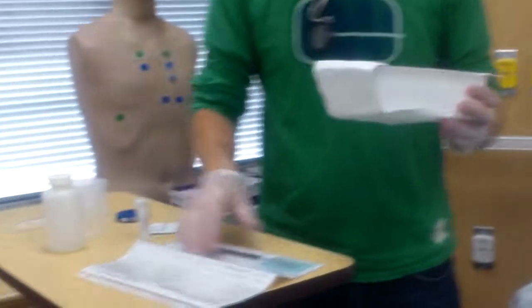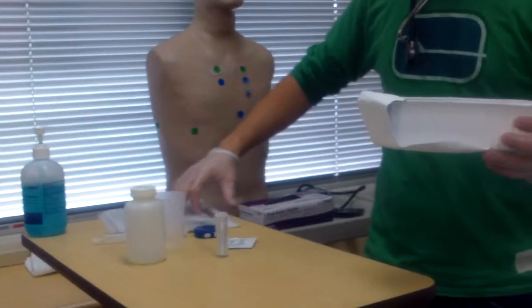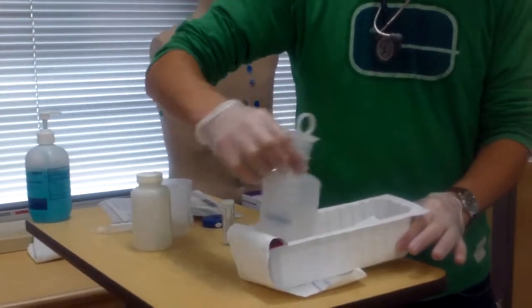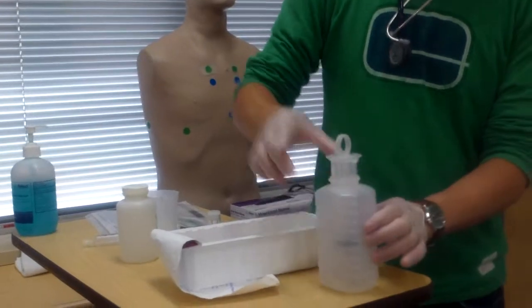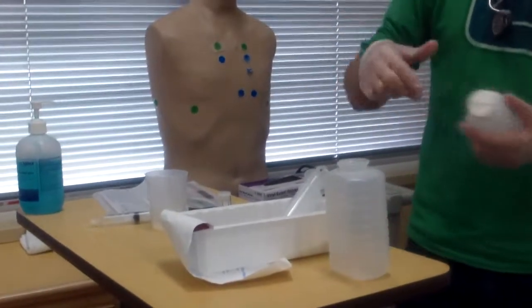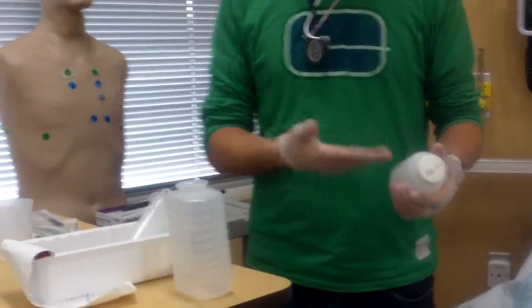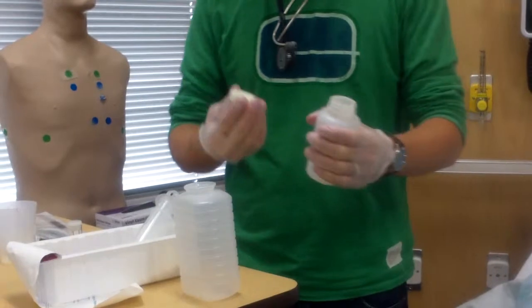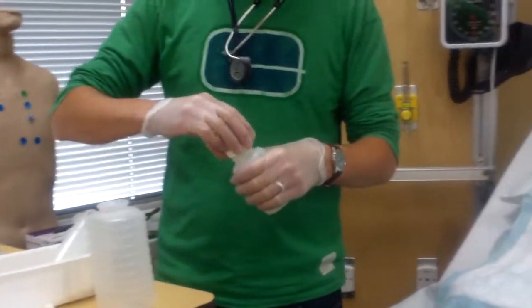Open up my thing. I don't want to get my marrow gooped up. I'm going to take this out. Okay, I'm going to set that there. I would use water for this, or you can use normal saline, which I have here. Expiration date is good, so I can just pretend it's water, pour some in there. Okay.